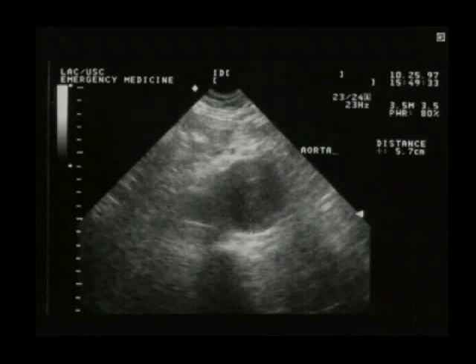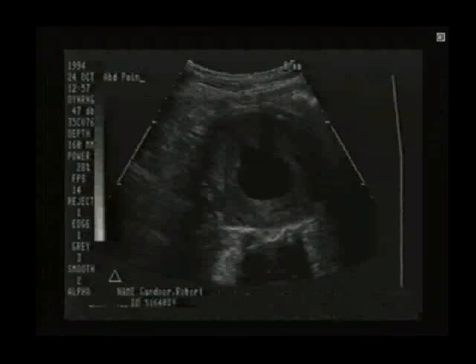How do you decide the outer wall? Well, this is a still shot, and so it may be difficult for you, but as you're scanning the whole thing, you'll get a feel of this is the wall, the outer part. Obviously, at most you might be off by 0.5 centimeter. Now, 0.5 centimeter, whether you're at 4 or 4.5, for our purposes, you know it's an aneurysm, you're going to move ahead. If it's that much a judgment call and you're worried about it, get a CT. You do not see the vertebral shadow that well on this one. But we do right here.